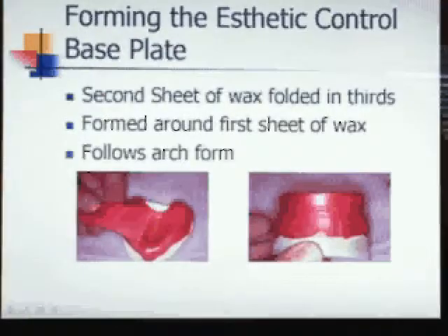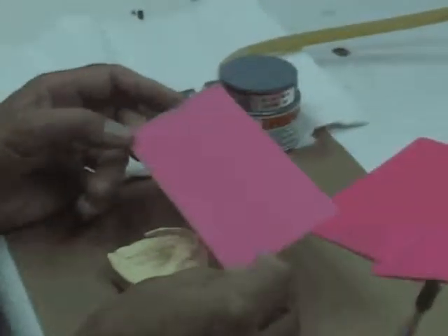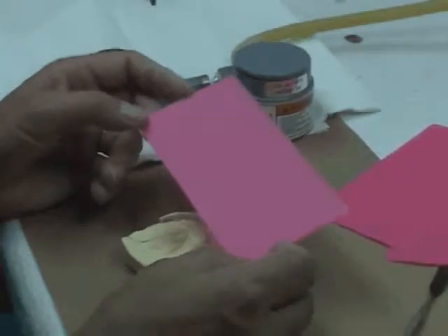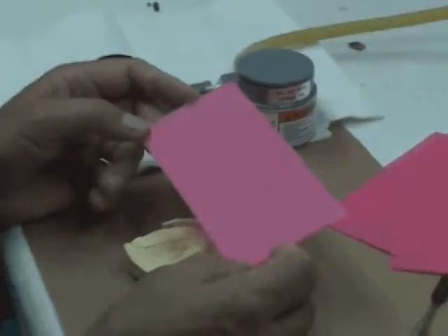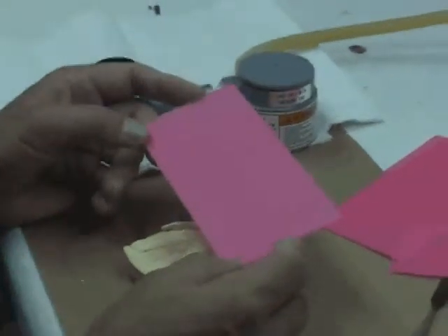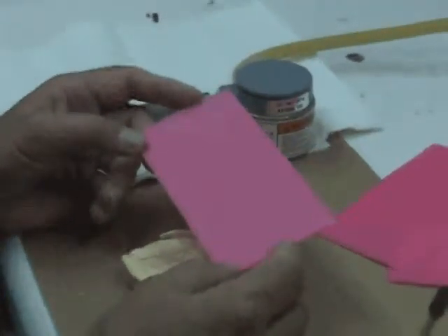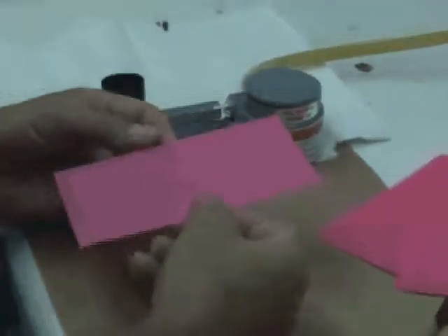Okay, now we're going to make the aesthetic control base, and the wax that we use is modern material SureWax, and this material is very nice to work with. It's stable. When we get the teeth set up on it, it's very easy to move the teeth around. It doesn't flake or disintegrate when you warm it up to move teeth around. And I've been using this wax for many years. We're going to warm it up.